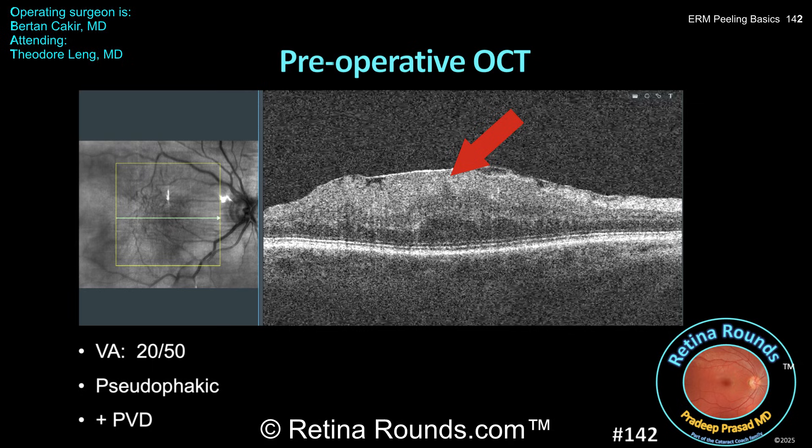The other finding is disorganization of the inner layers of the retina, most likely due to chronic tractional forces. These findings make this a stage 4 ERM, which carries with it a higher likelihood of poor vision at baseline and possibly poorer visual prognosis than lower-stage ERMs. At the end of the case, we'll review in more detail the staging of ERMs and other OCT biomarkers to be aware of.